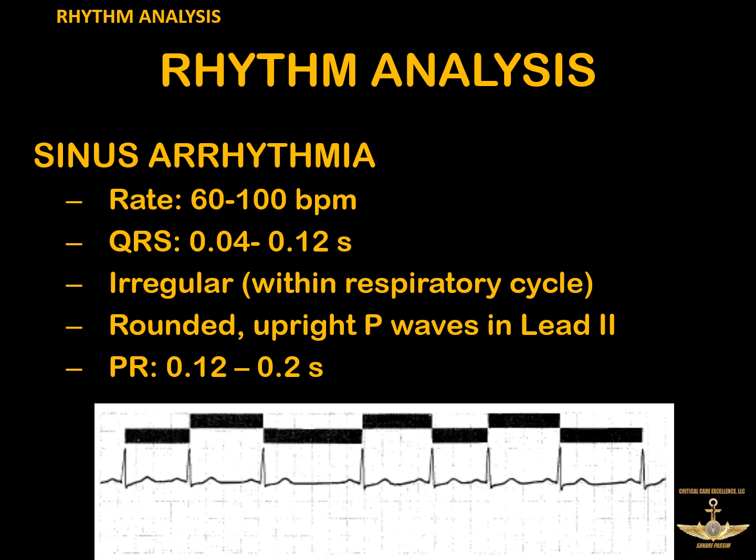Sinus arrhythmia is a pretty quirky one, and you typically only see it in an academic sense for testing purposes. But it is usually completely normal except that it has an irregular rhythm, which is usually related to the respiratory cycle. You can see the example we have down here. We've got these little black bars where you see it gets longer and shorter and longer and shorter.